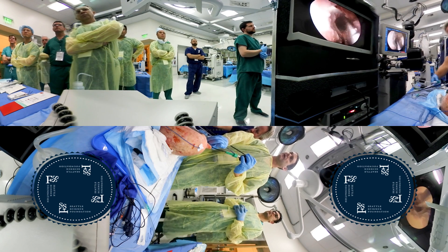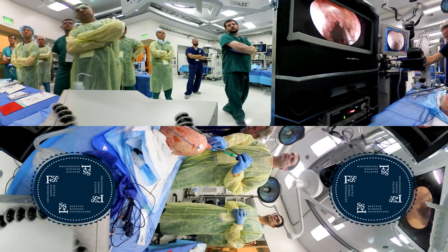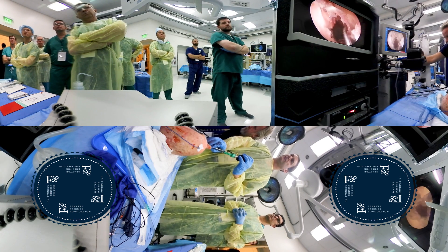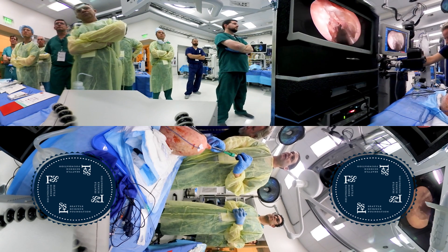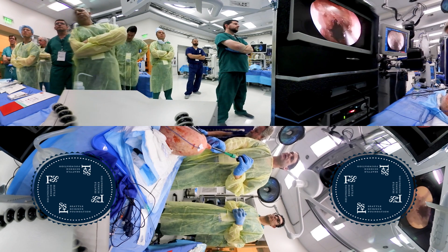My colleagues have already done a very nice ethmoidectomy. I did come back and peel off the mucosa, which is key because we want this lamina to come off easily.